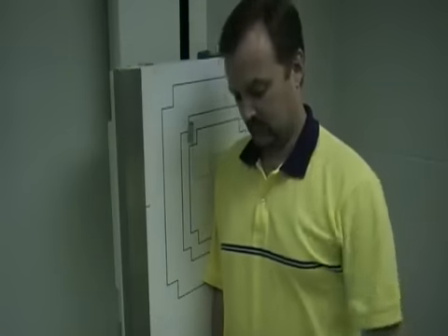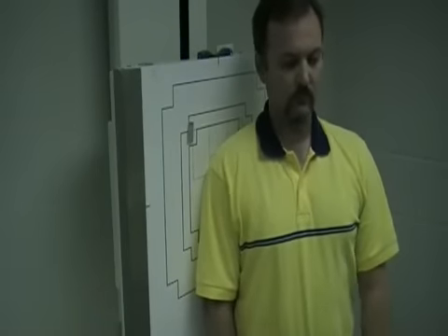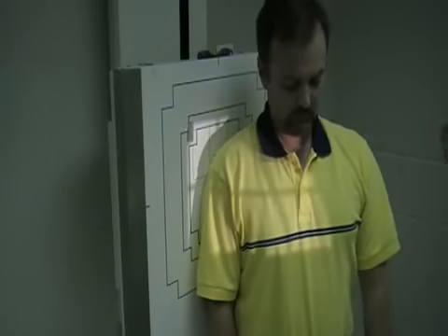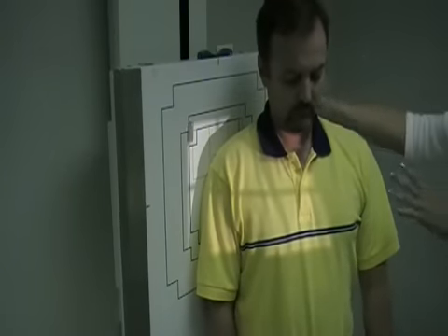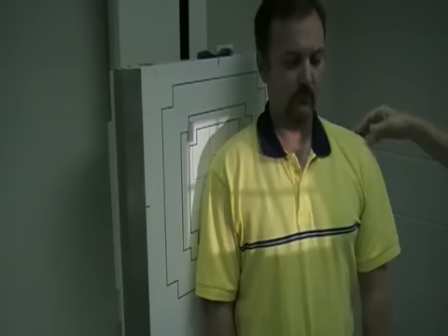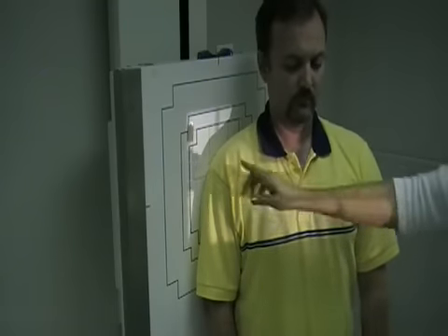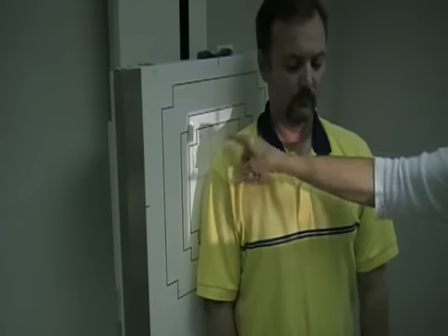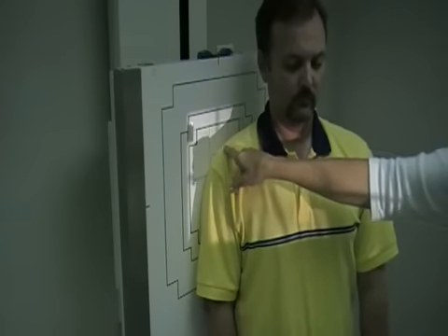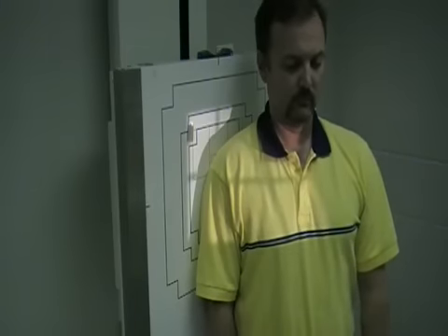Next, I'd like to show you the Grashey method, which shows the glenoid cavity. So we're going to image the right shoulder. You have the patient at an oblique angle of about 35 to 45 degrees. Our central ray is going to enter. You're going to start at this farthest portion of the shoulder and go in 2 inches and then come down 2 inches. So I can actually go up just slightly higher.